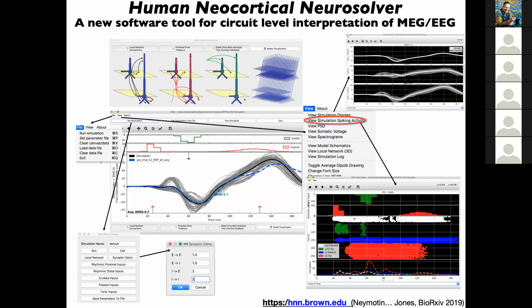They tend to have canonical shapes, which I'm now realizing through studying more and more signals. If that's true, then we may be able to target specific waveforms, specific oscillations, and give people the tool that they want, which is to put in a waveform that has a shape where we at least know the prior space of where it could come from. And then we can optimize on that prior space in the model to tell you how the brain generated it. So we might get there, but right now it's more of a hypothesis and development tool with some limited optimization.